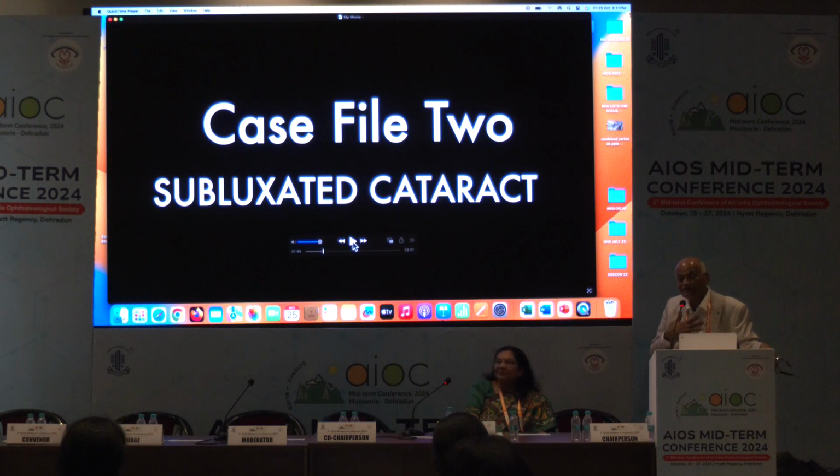If you have made 2 pieces, come out. Make a habit, come out, put a visco. Make 4 pieces, come out, put a visco. Then emulsify 2 pieces, come out, put a visco. What will happen? It is a 3 ml visco.